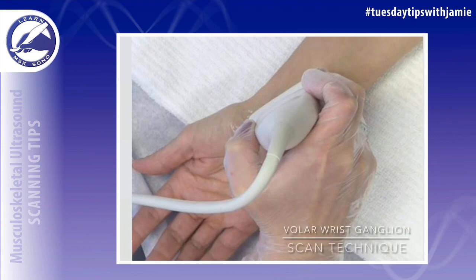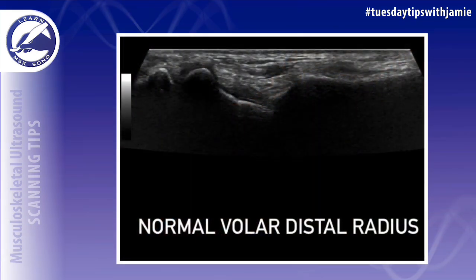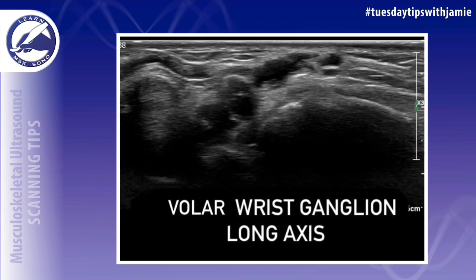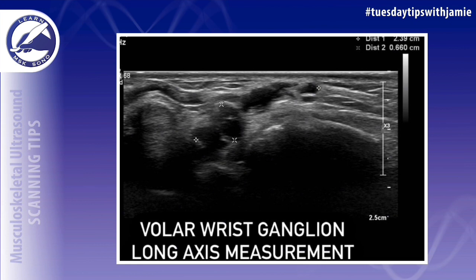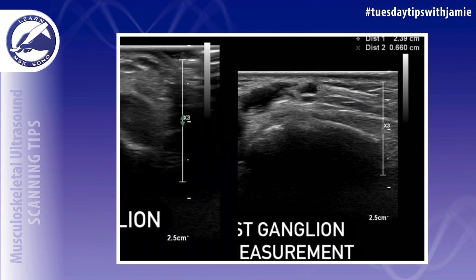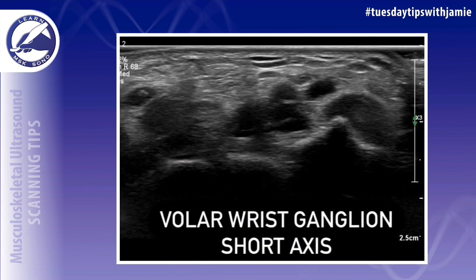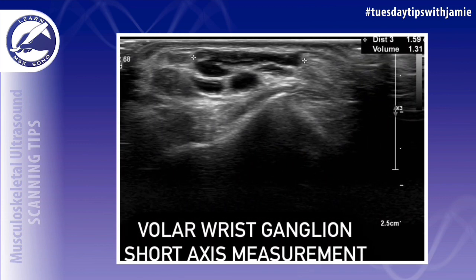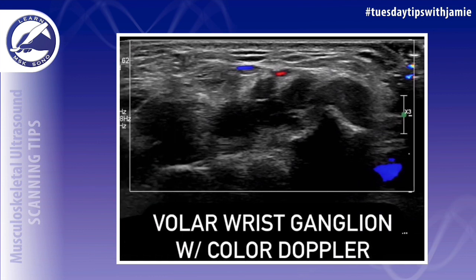If you assess the other side of the wrist on the volar surface, you can elongate the distal aspect of the radius to look for a ganglion cyst here. As you can see, it usually lies just distal to the radius, but it usually arises from the scapho-trapezium joint. The length and AP should also be measured in the long axis, and also the transverse measurement in the short axis, and assess with color Doppler.